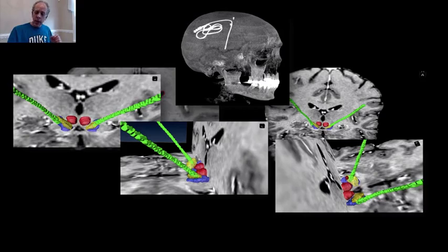Electrodes actually have multiple contacts. Some have 4, some new ones coming to the market have 16. These post-op images can help the programmer say which one of the contacts will be more effective according to the position where I have localized them.